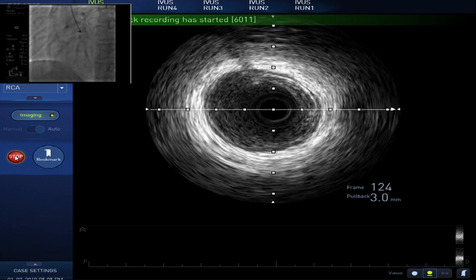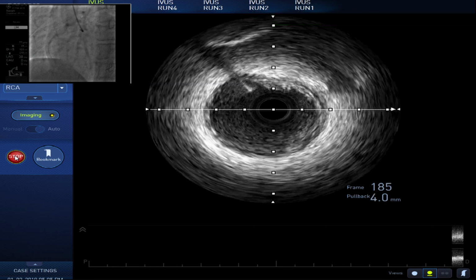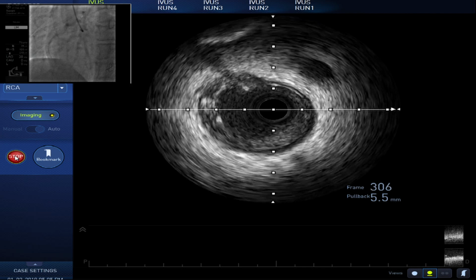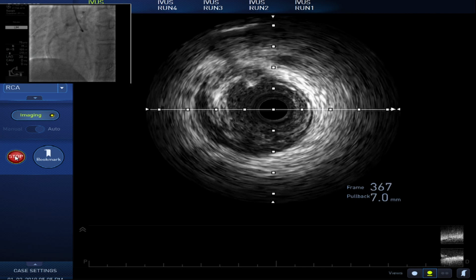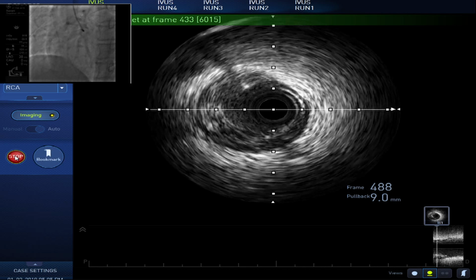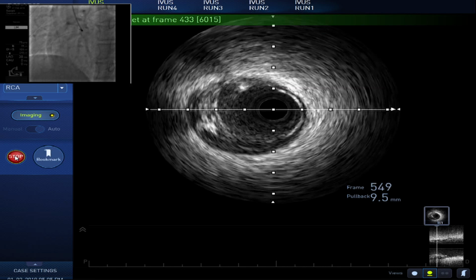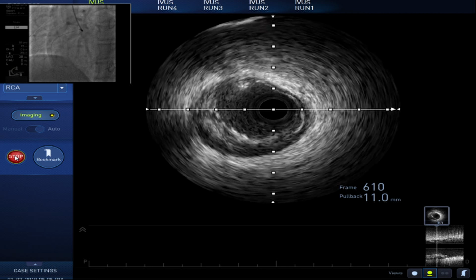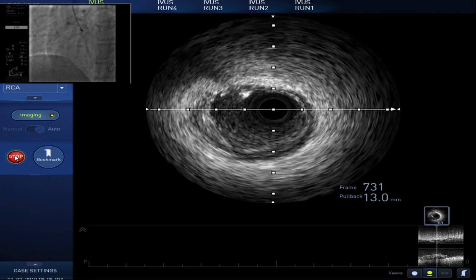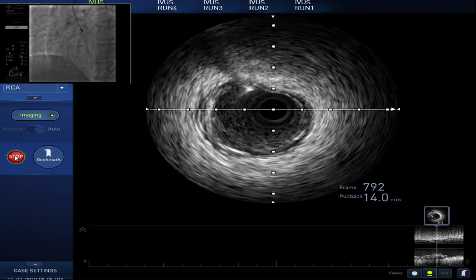Almost normal here, right? Yeah, right here is normal, good. Yeah, some plaque is there, some very fibrous plaque, but it's okay. Yeah, here is the area I need to start from. And the plaque volume is still not so big, right? Moderate plaque. But I should cover that if my stent can go down.